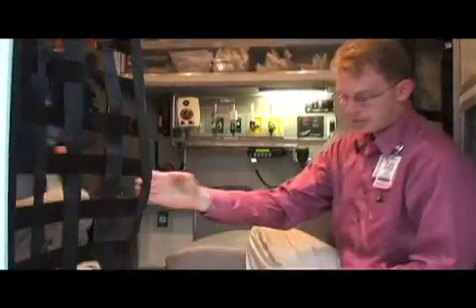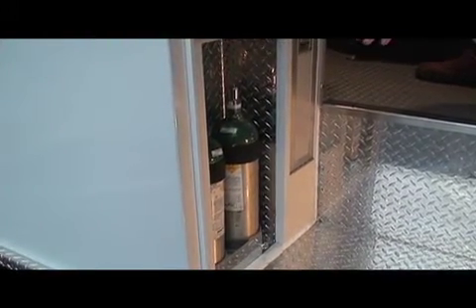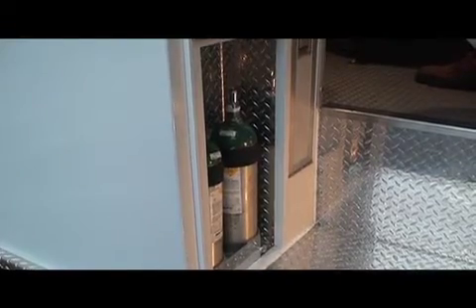On the inside of this truck, you have two portable oxygens that will always be here. These are both D cylinders. So if for some reason you do need extra oxygen while you're in the ambulance, then you have these cylinders here. The regulators go on top and stay on the tanks at all times. They haven't been put on in this truck yet, but they will before we put it in operation.